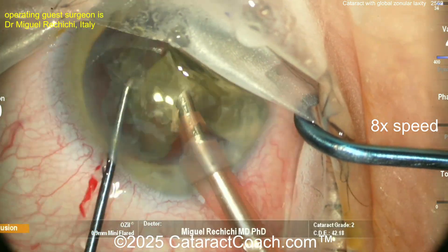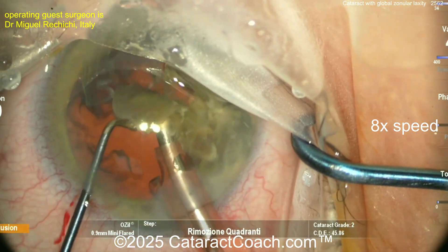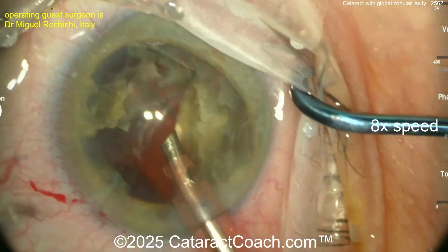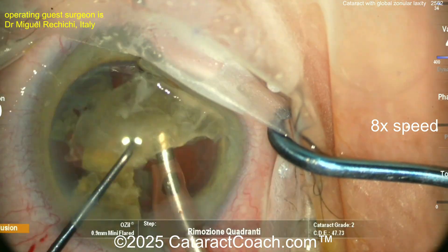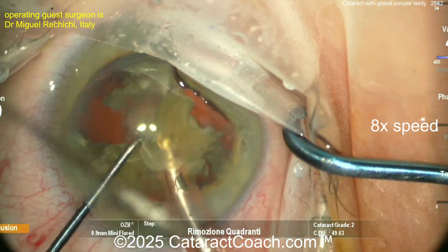He's an experienced surgeon and does a great job here. Keep in mind this video, unedited, was about 30 minutes long — so that's okay. Things can take time. You have to be patient. Going into the rest of the nucleus, just aspirate this down. We'll slow it down when it's time to insert the CTR and the IOL.